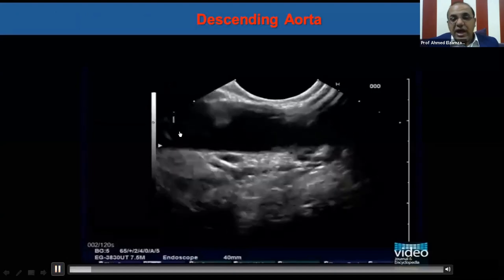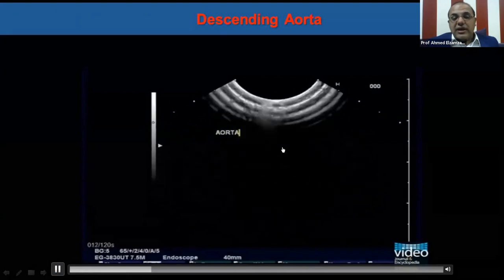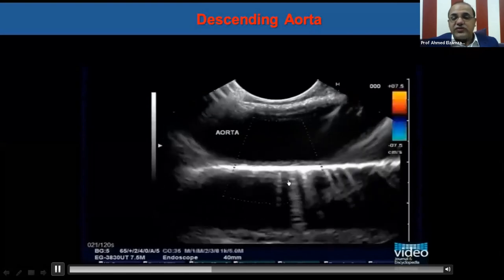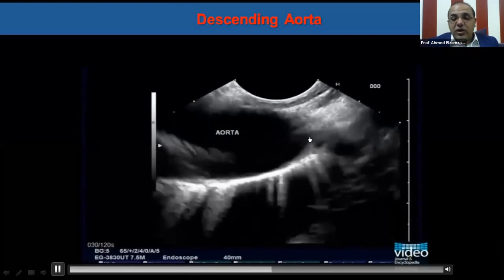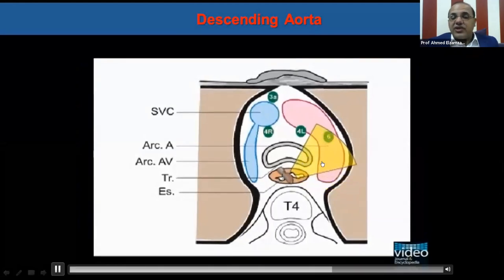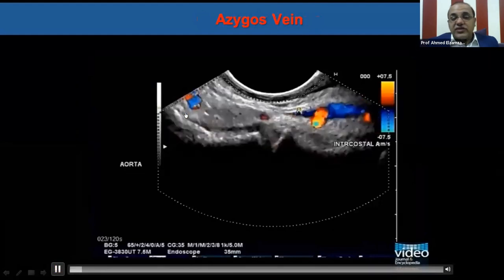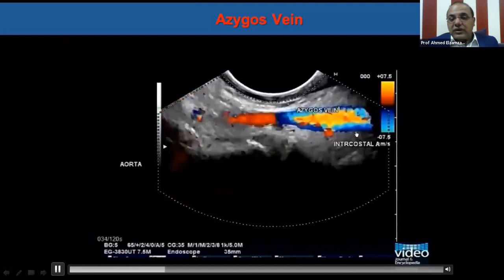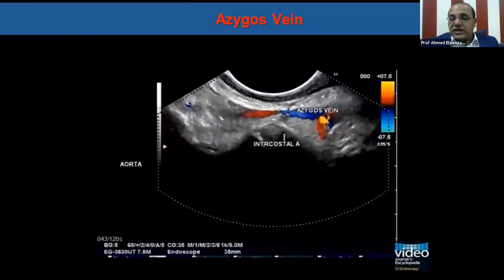This video shows the descending aorta and the gastroesophageal junction. We withdrew the scope more and more until we reach its upper end point, where we can do clockwise rotation to trace the arch of the aorta and its branches — left common carotid and left subclavian artery. This video shows the azygous vein, which extends from 40 centimeters to 25 centimeters, ascending close and parallel to the esophagus, where it arches above the right root of the lung to join the superior vena cava.